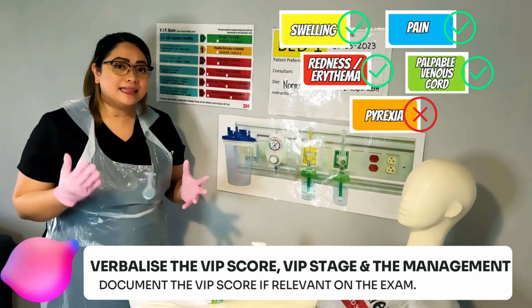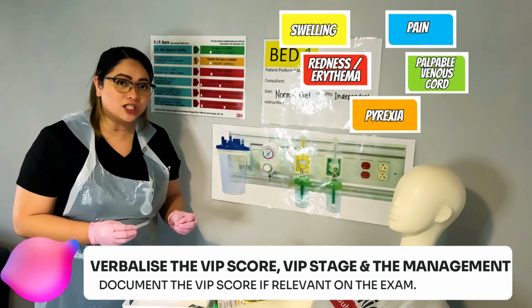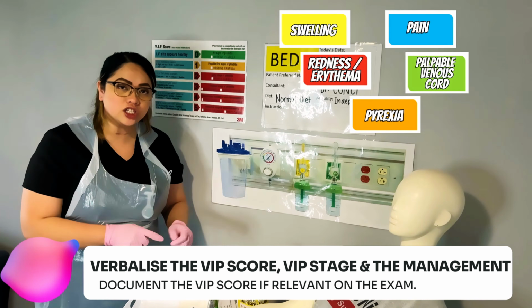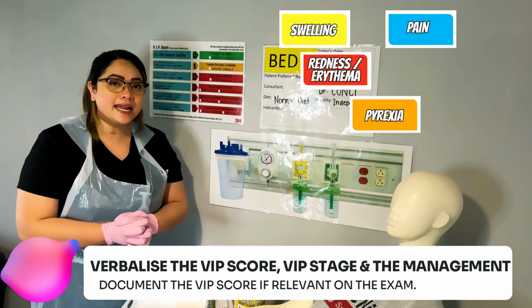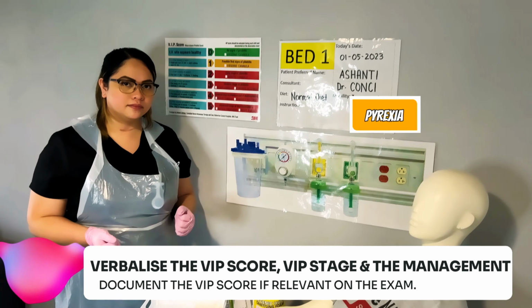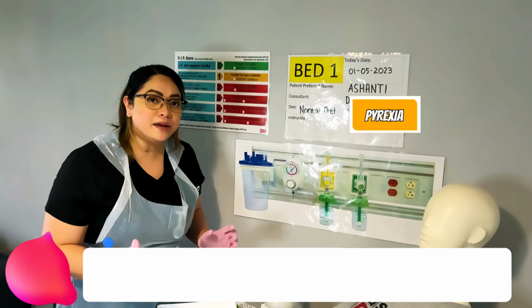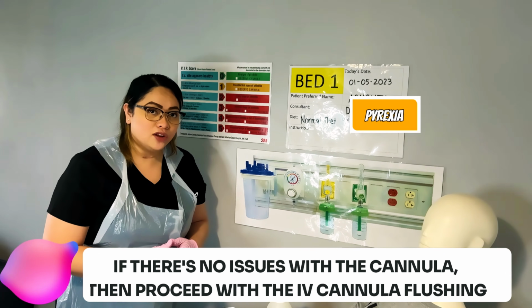Miss Examiner, at this point, I'm not going to flush the cannula. What I'm going to do is to resite this cannula, okay? I need to reposition this cannula elsewhere, and I need to consider treatment for the IV phlebitis. The cannula has been resited. Okay, since the cannula has now been resited, I am now going to give the IV flush, okay?